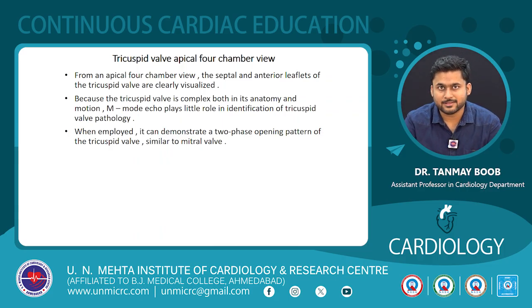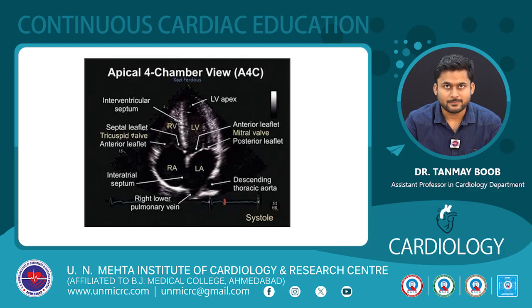Because the tricuspid valve is complex in both anatomy and motion, M-mode echo plays very little role in identification of any tricuspid valve pathology. When employed, it can demonstrate a two-phase opening pattern of the tricuspid valve similar to the mitral valve. This is an apical four-chamber view demonstrating the septal leaflet and the anterior leaflet of the tricuspid valve.